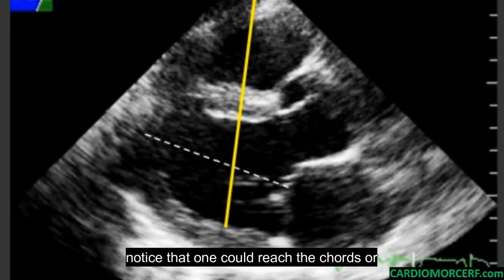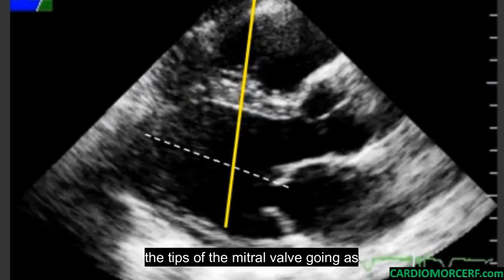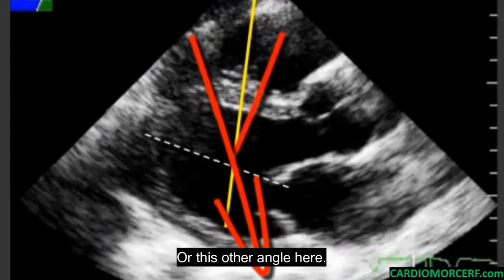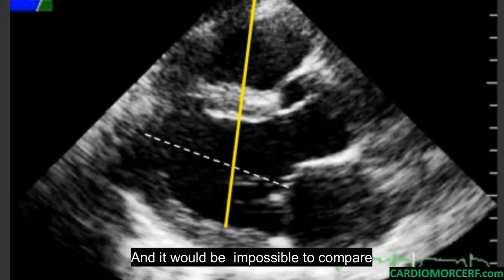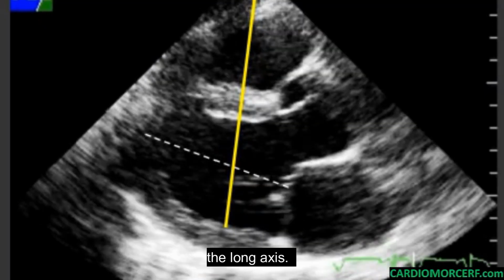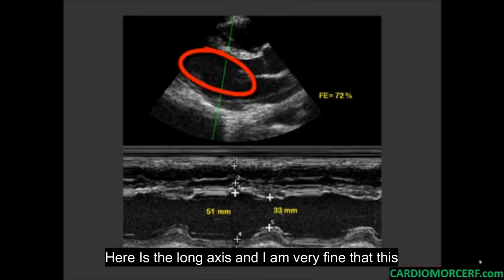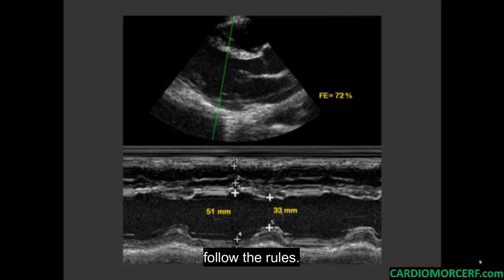Notice that one could reach the chords or the tips of the mitral valve going as oblique as this angle or this other angle here, and it would not be possible to compare with future measurements if we do not see the long axis. Here is the long axis, and I am verifying that this is the best M-mode cursor position to follow the rules.